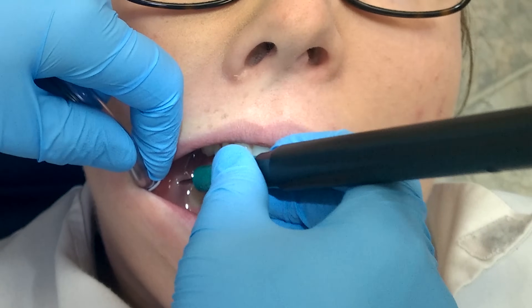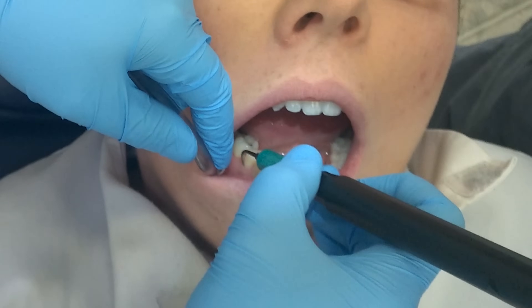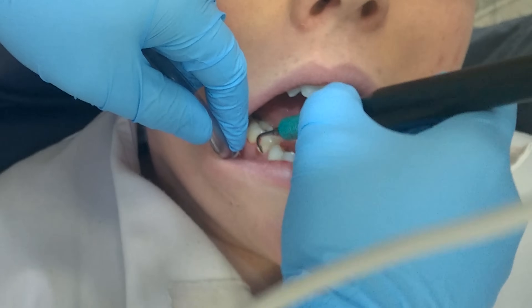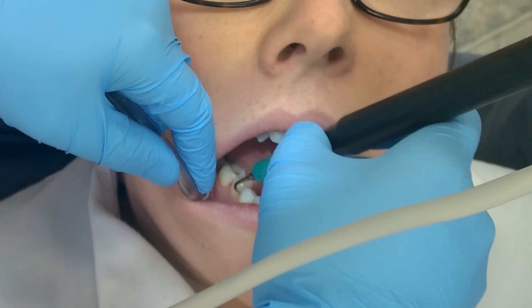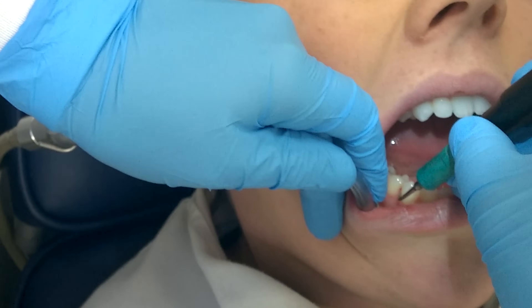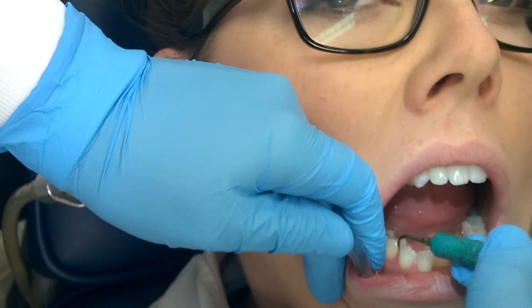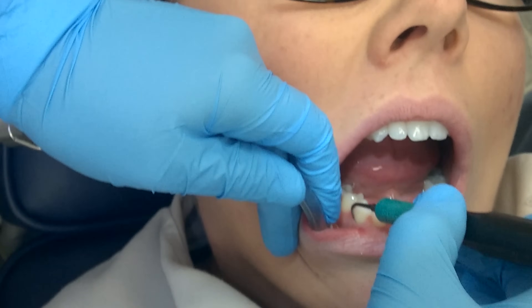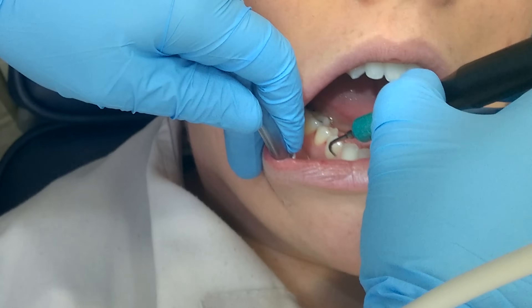I'm going to demonstrate retraction with the suction while using the ultrasonic. This particular tip is called the slim line, used at a low to medium power setting. As usual, you want the water to have a fine mist so it doesn't overheat. Really make sure with your ultrasonic technique that you are using the lateral sides and not so much the face or back side of the instrument.